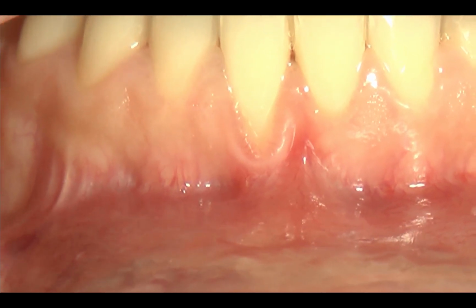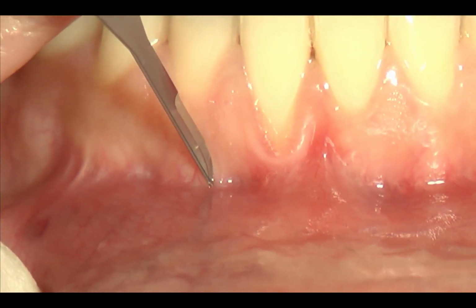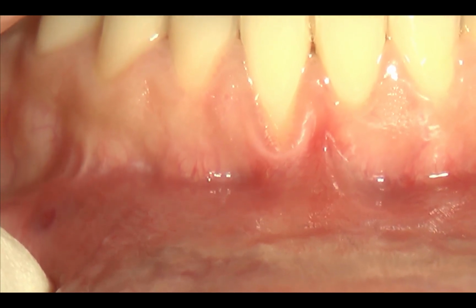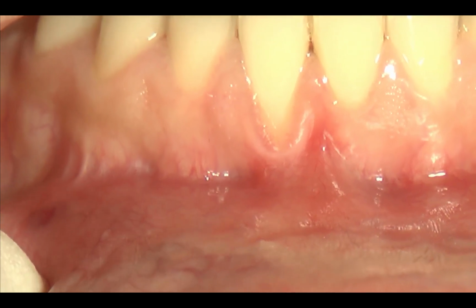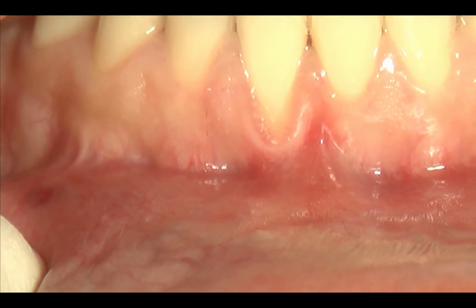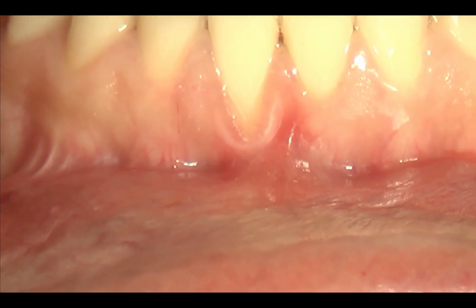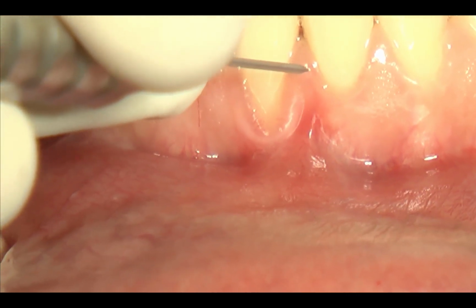because you have a good amount of keratinized tissue, and also the vertical releasing incision should be extended for the moment, the less you can in alveolar mucosa. So this will improve your manipulation and your surgical elevation of the split thickness papilla. While the mesial papilla is much more difficult because you have less amount of keratinized tissue.